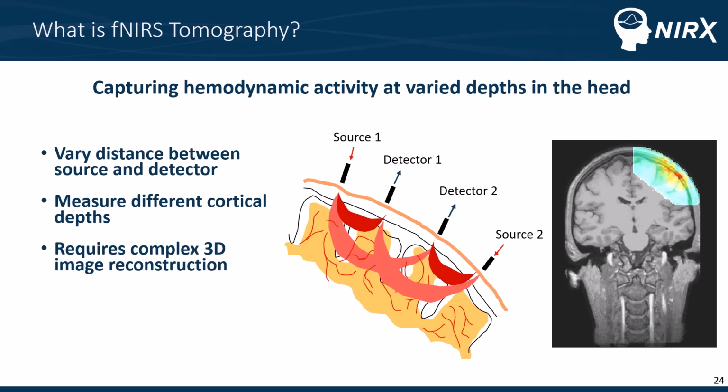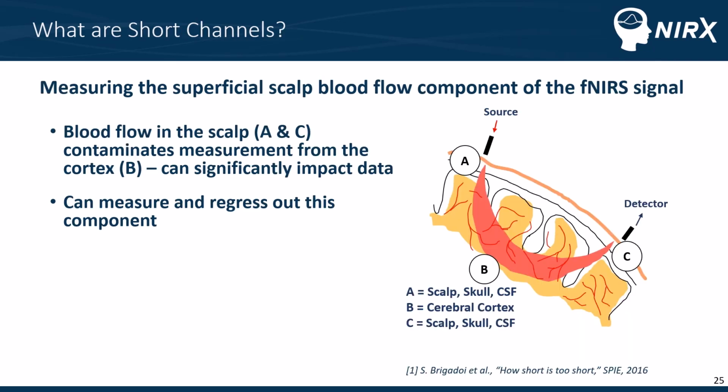So this is a much more intensive form of imaging, certainly when it comes to analysis. It does require quite a bit of legwork in order to produce these 3D reconstruction images. But with this 3D reconstruction, you can get a better sense of where exactly in the tissue activation occurred. So overall, this is not as commonly used in the field except for short channels.